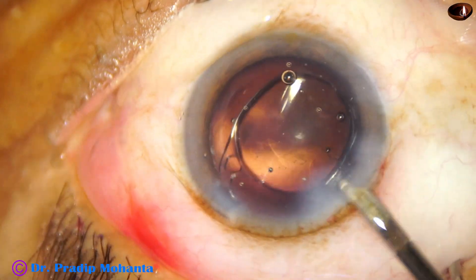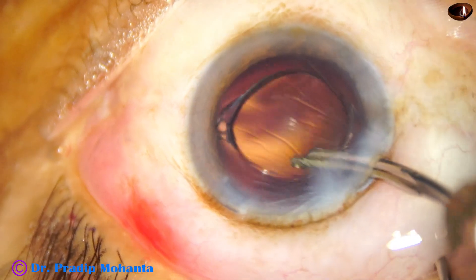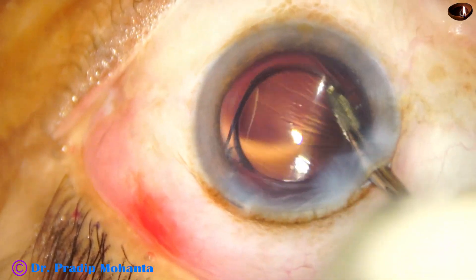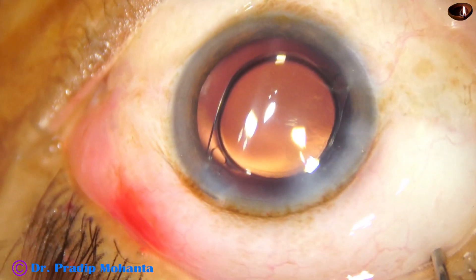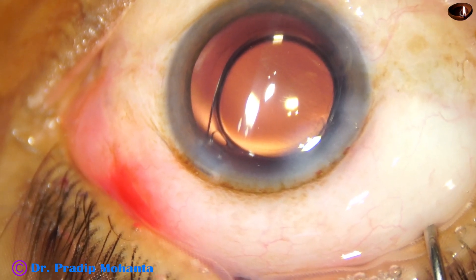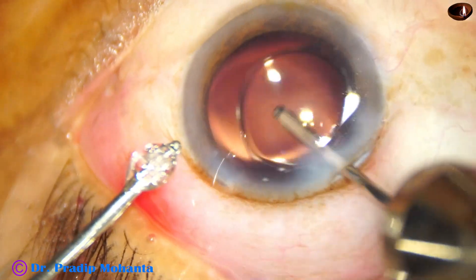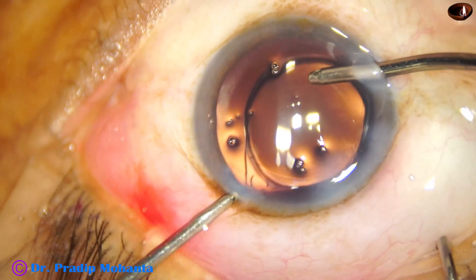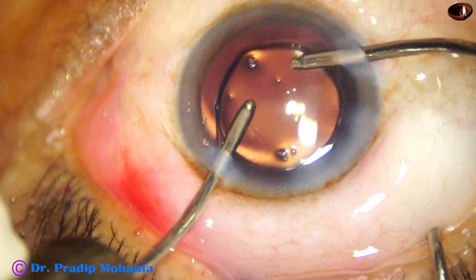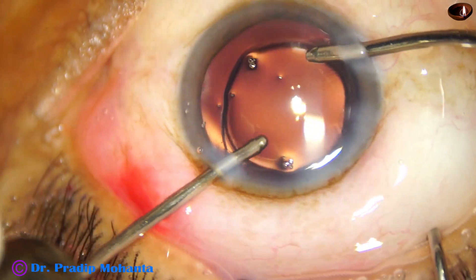Now you must thoroughly remove the viscoelastic substance that you have used for implantation of the intraocular lens. Unless you remove this Visco thoroughly, you will have raised intraocular pressure, steamy corneal edema, and poor vision the next day. Use bimanual irrigation-aspiration for removal of the Visco. Don't be afraid to go behind the lens with the irrigation only.